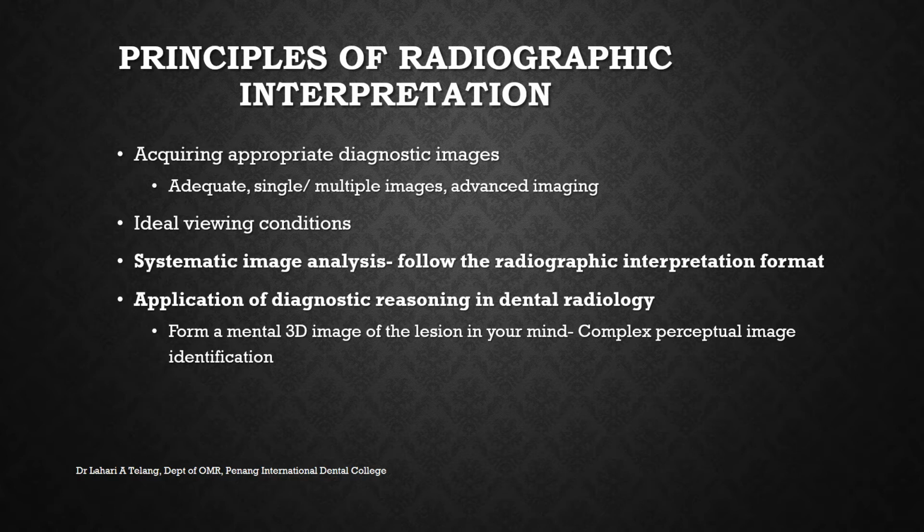A simple format for dental radiographic interpretation, for example, starting with normal landmarks, following the crown, root, periapical lamina dura, PDL space, and then coming on to the apical region and bone, would be the best method to analyze the image without missing any points.